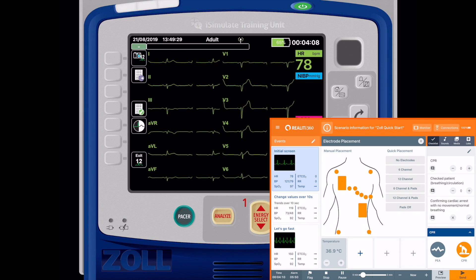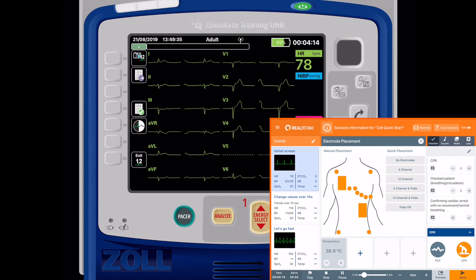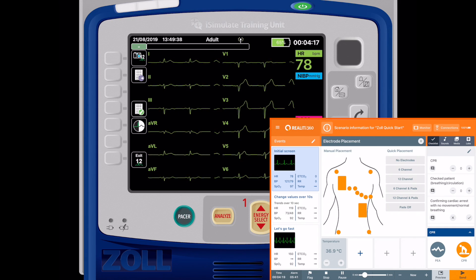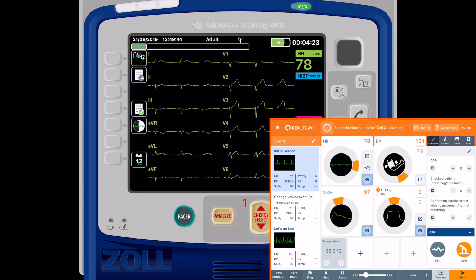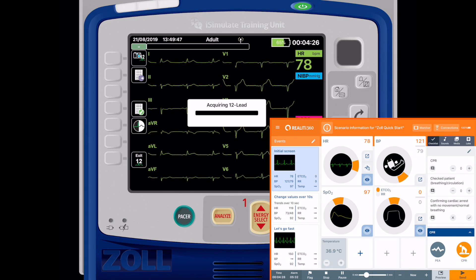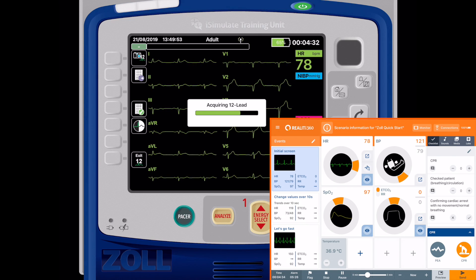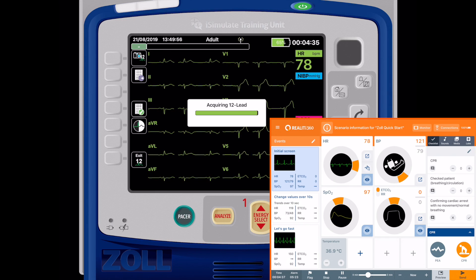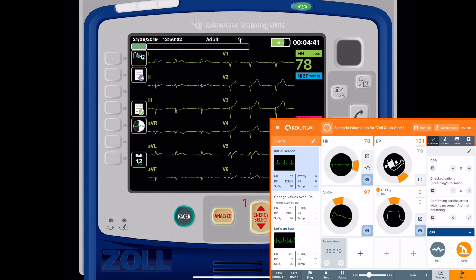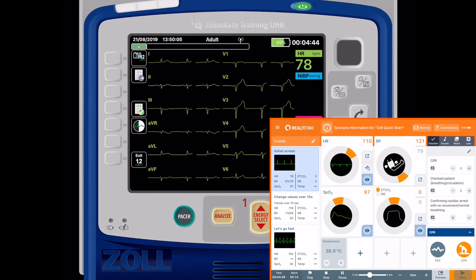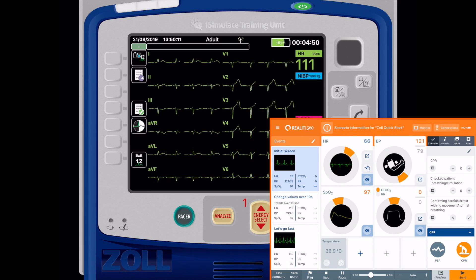If for example I want to lose V5, I just tap on V5 and that goes to a dotted line, and I can bring it back again. So you can really do very accurate ECG training with this now. Remember of course you can change the heart rate by going faster and all of the leads will change, and of course slower as well.